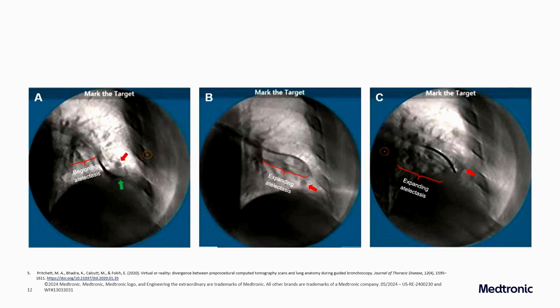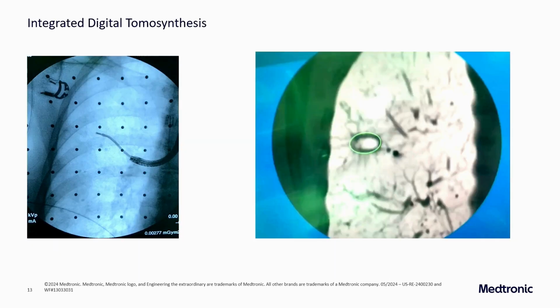And so you need to be able to adjust for that during the procedure, or maybe adjust a couple of times during the procedure. I'll just give you an example of how that works. We started using this in 2018, I think, is that right? 2018. We're kind of blown away by what it does. So here's a conventional 2D fluoroscopy where you really can't see the cavitary lesion at all. And here's what you see with this, a coronal CT cut.